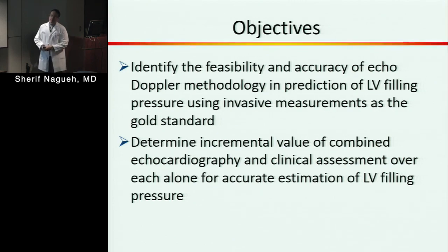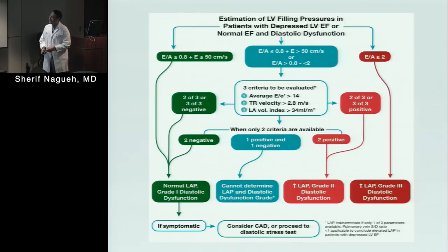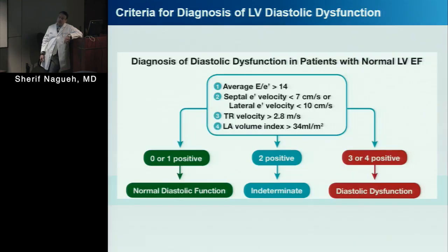It's very interesting. Go back to what you said. Remember, in the past, you had 4 criteria, right? Now, if I don't have all 4, I don't have to necessarily decrease my number of criteria to still keep it either positive or negative.